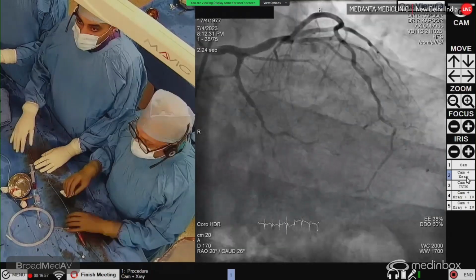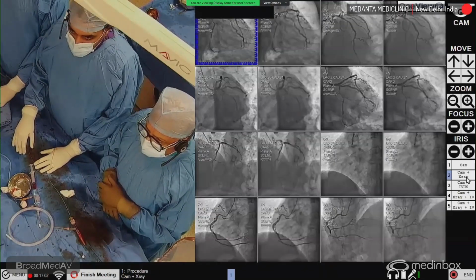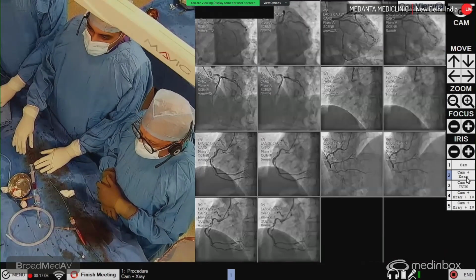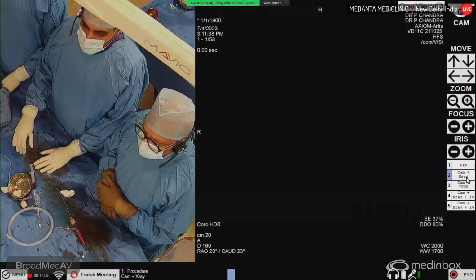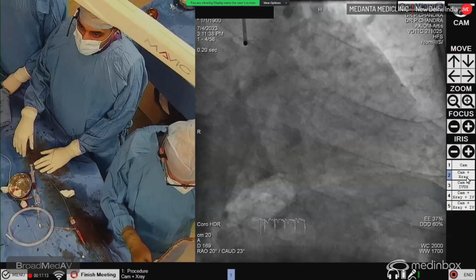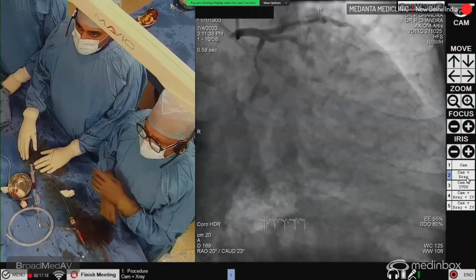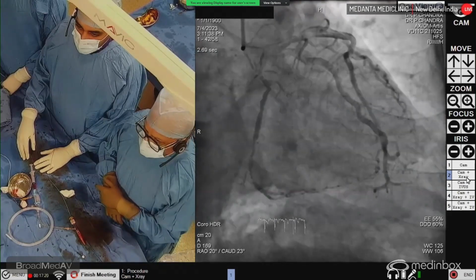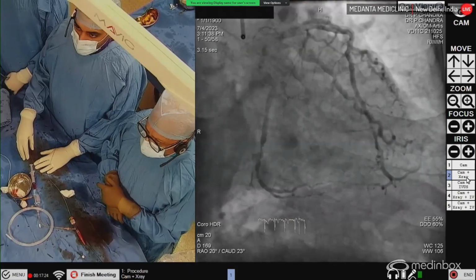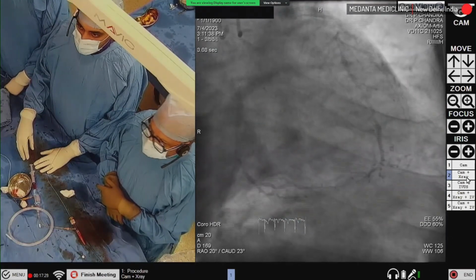Hi everyone. Our patient is a 46-year-old gentleman who presented with a chief complaint of dyspnea on exertion for the last few days. He has a past history of angioplasty to the RCA, a primary angioplasty, as he had an inferior wall MI in March 2023. Now he is planned for an angiogram, which revealed the circ having a proximal lesion of almost 80 to 90% and a distal 90% lesion. The LAD also has significant disease in the proximal part, around 70 to 80%.